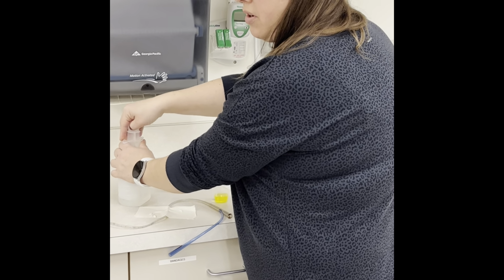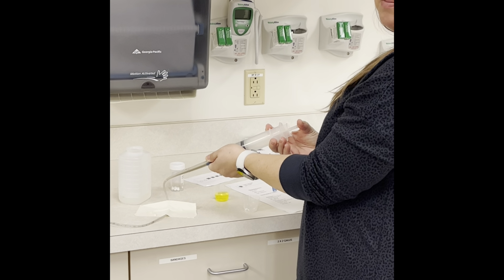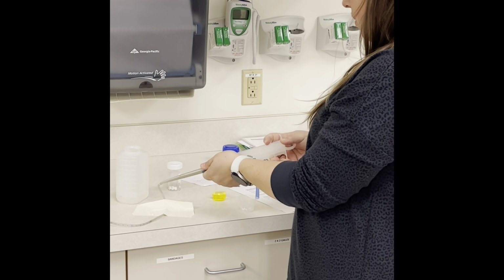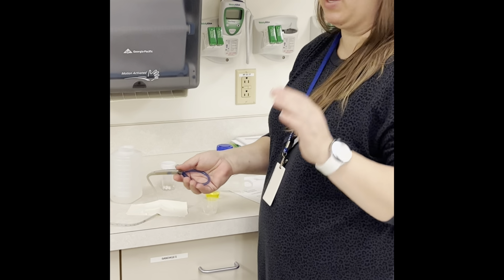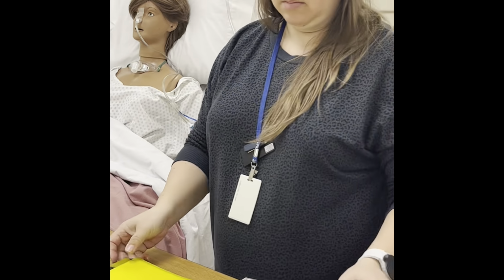Take like 10 to 20 water. Flush it through. Okay, nice and slow. Then we repeat this process, but we want to wait 30 minutes to restart any feeding or the vacuum afterwards. That's the big thing. All right, now we have to go take the tube out.